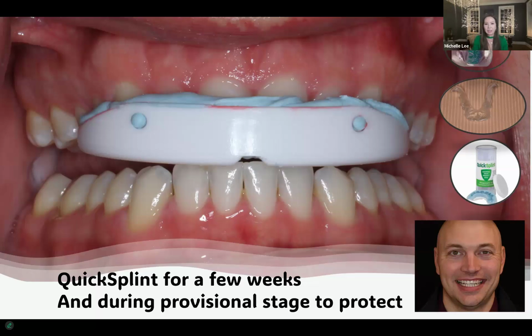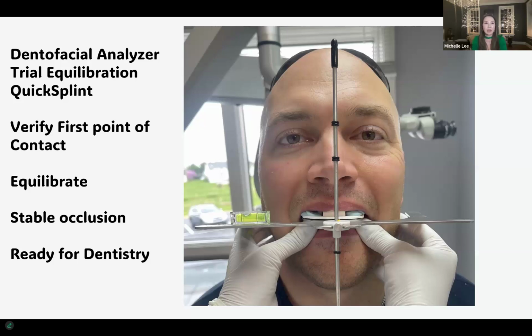So he's in the quick splint, he comes back, and we do the dental facial analyzer. I do a trial equilibration for him on the model, and I call it bite harmonizing. What was really amazing for Jared, he was like, oh my goodness, thank goodness you're looking at my bite, because I don't think my bite is even at all. He was really open and welcoming to the fact that we're starting from a solid structure, healthy joints, even bite. Then I said, Jared, we can do the dentistry. Then that's a go. Super excited about that.